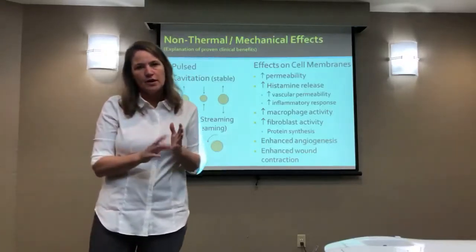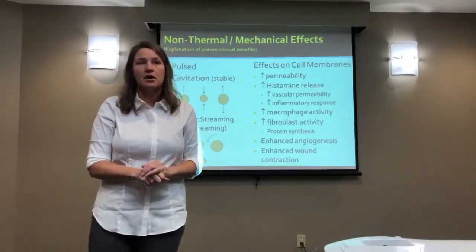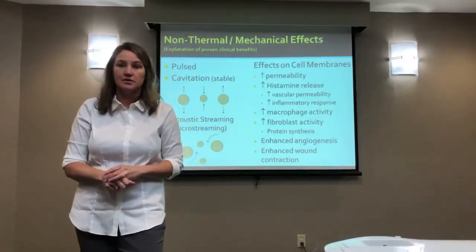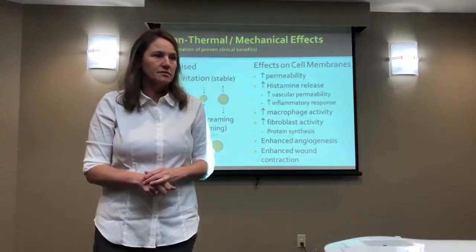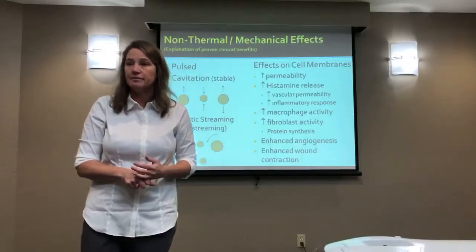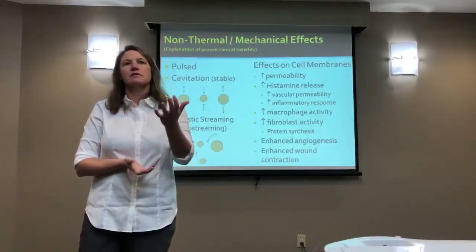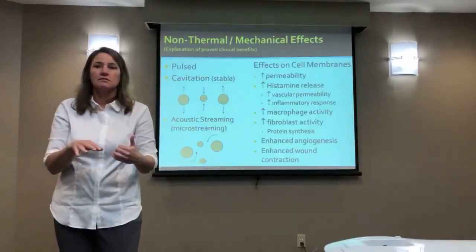So when you do a non-thermal treatment, and actually a book that I read recommended not calling it a non-thermal treatment. The reason is, it makes you assume at a certain frequency and intensity that you're not going to have heat buildup, which is not necessarily true. What makes a non-thermal treatment non-thermal is blood flow. Vascular tissue that has adequate blood flow is not going to heat up. It's going to have minuscule heat rise. The energy being delivered is still causing kinetic energy, but there's not enough of it, and the vascular flow is keeping it down at a level that's considered non-thermal.